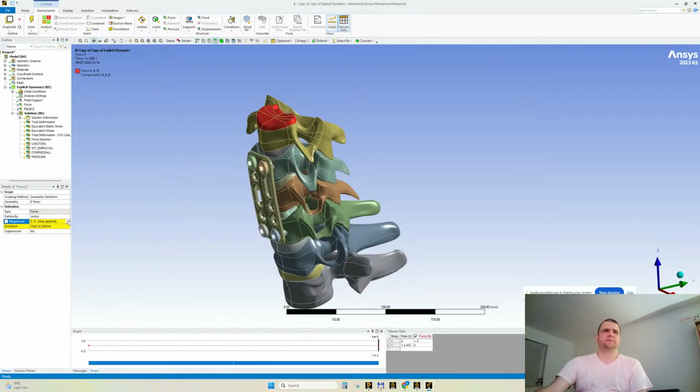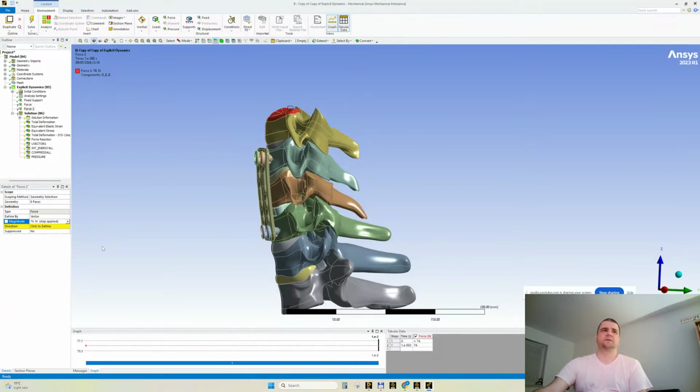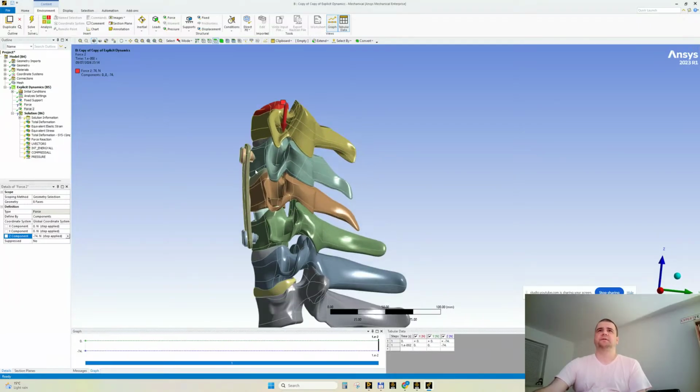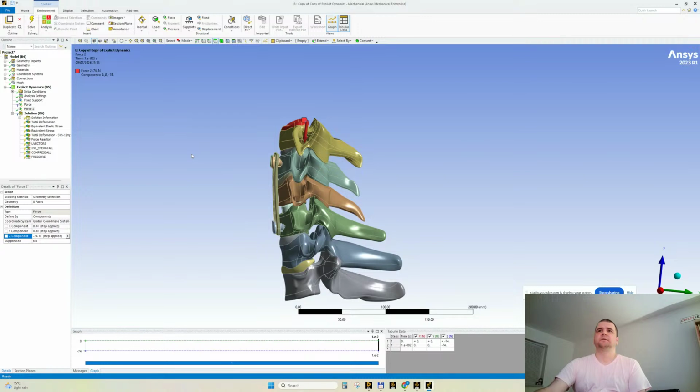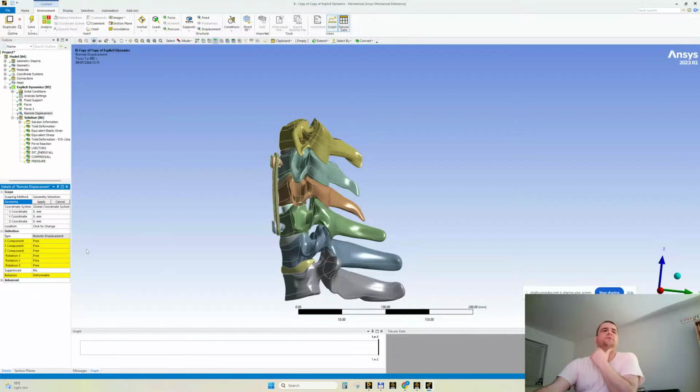33.6. Let's make it 73.6. Let's make it 74. Click to define what? The direction is almost on the Z direction. Minus 74. How do I create a moment? I do have a remote displacement and I have a rotation here, but this is a displacement, it's not a moment.